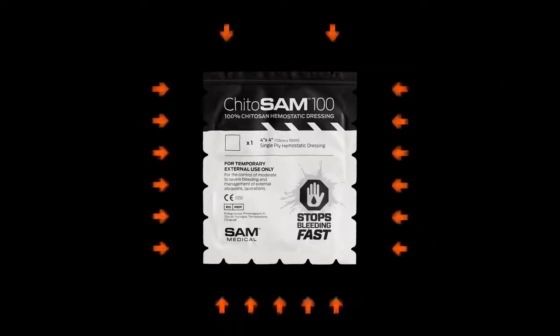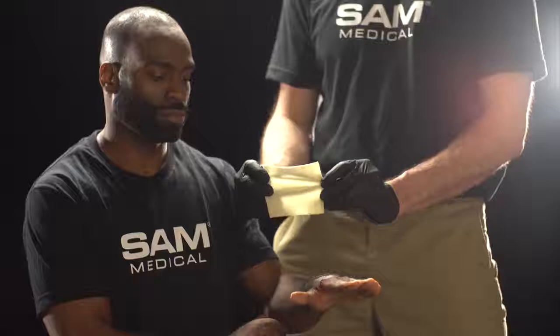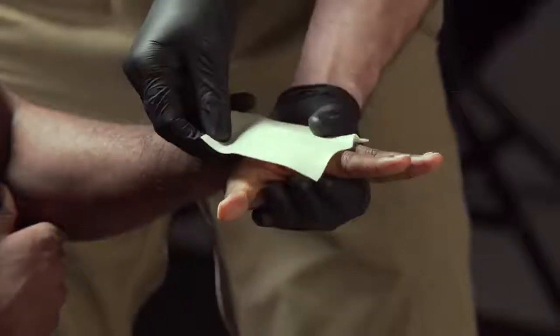Quickly open the Kaidosam 100 and remove the 4x4 dressing. Kaidosam's Tear Anywhere Package design allows it to be quickly opened at any location. With gloved hands, apply Kaidosam 100 directly into the entire area of the wound.